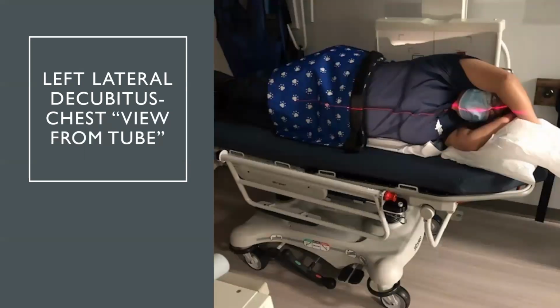Part position. Adjust the patient so that the patient's mid-sagittal plane and T7 are centered to the IR. CR location. CR is horizontal and centered to the level of T7, which is 3 to 4 inches inferior to the level of the jugular notch. CR angulation. We do not have any type of angulation on the tube.